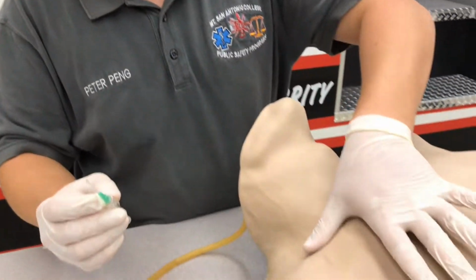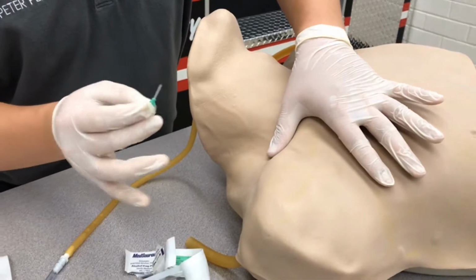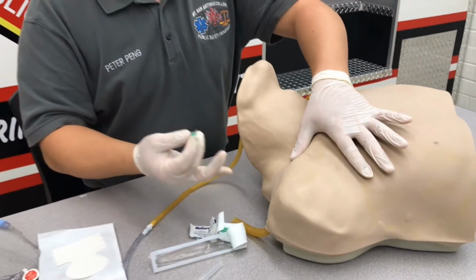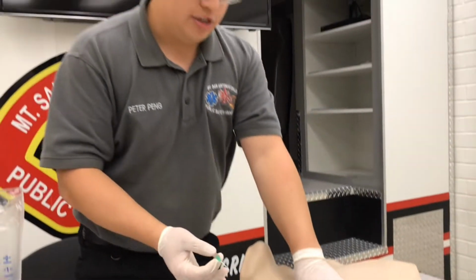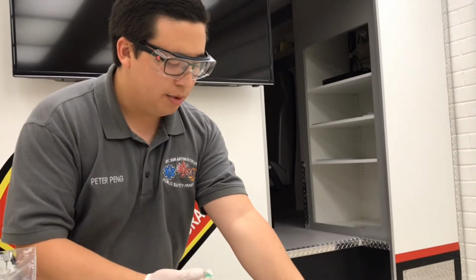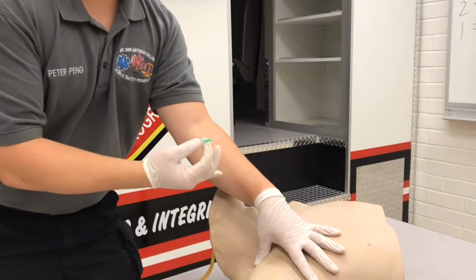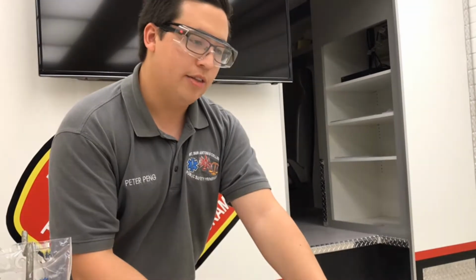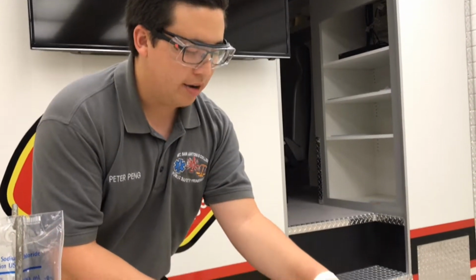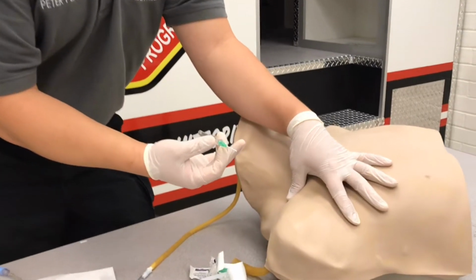I'm gonna put my thumb back at the base of the clavicle here, and that serves two purposes. It's going to stabilize the vein, and it's also helping to bring the vein up. One other consideration you might wanna do is put your forearm on the patient's jaw to hold their head over to the side. You always want to have their head turned toward the opposite side that you're poking, and putting your arm there keeps them from flinching and turning their head back the other direction.